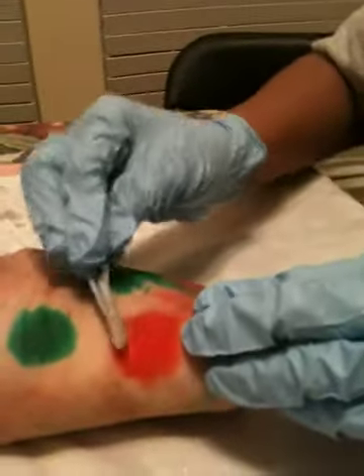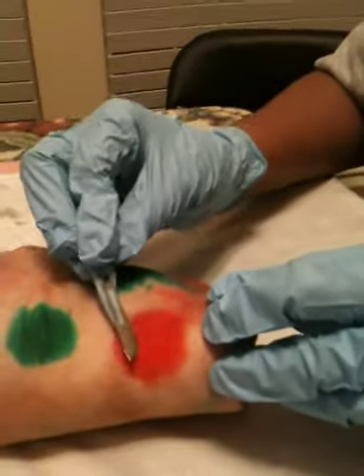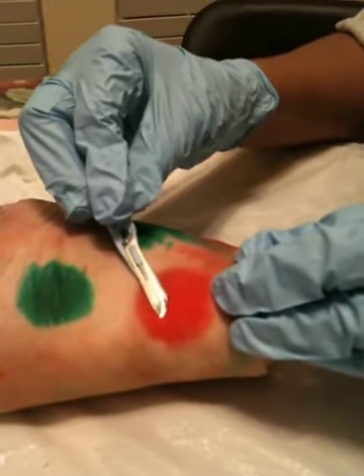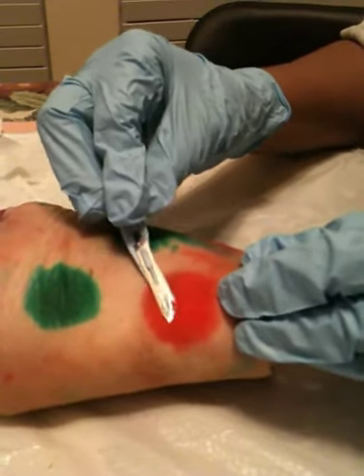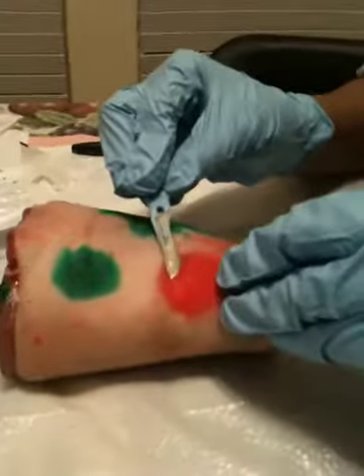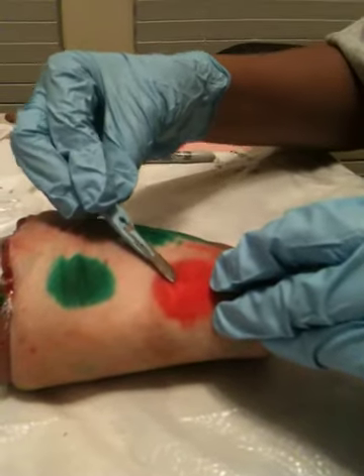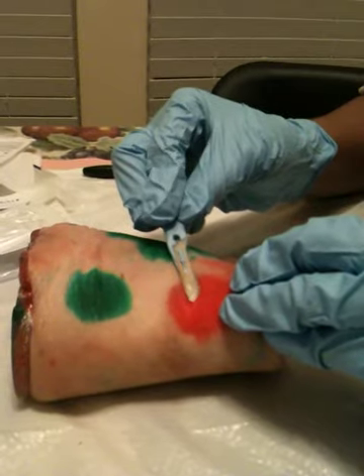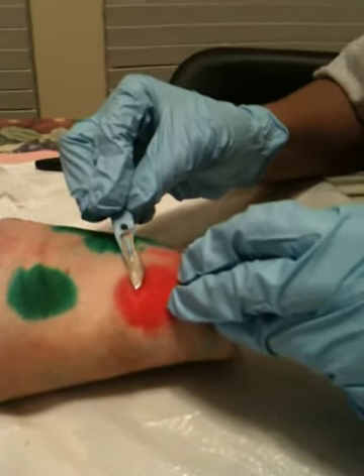So again, it's held between my third and fourth finger. Gentle sawing motion. All this while my forearms are nicely supported.